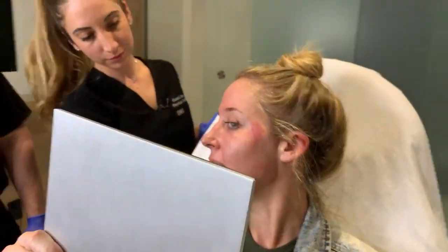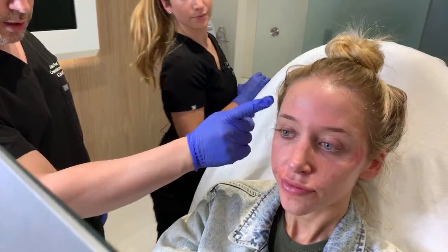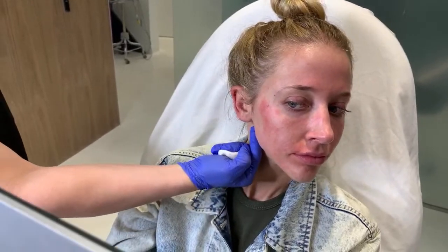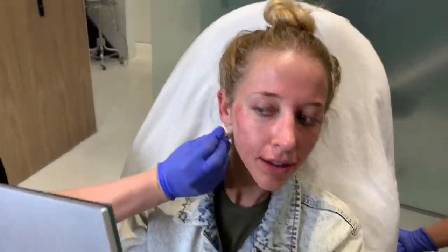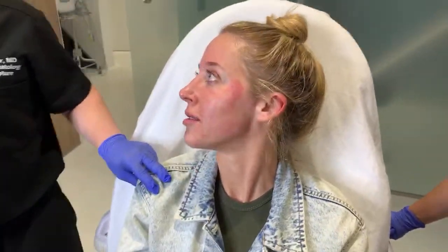Isn't that nice? So we have now lifting and softening through the eye and cheek, balancing with the temple, and now a little bit right here, just to give that chisel effect. The chin, now look from the side. See how the chin comes forward a little bit more? It's so subtle though. But it balances, and then it matches the lips. So it's perfect. Thank you so much. Happy early birthday.